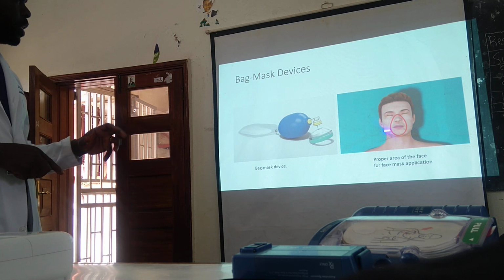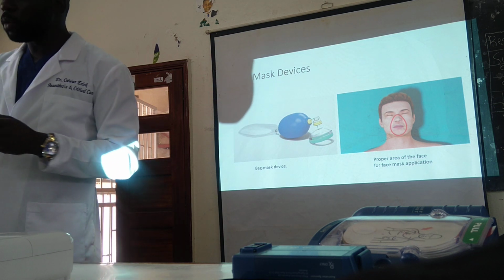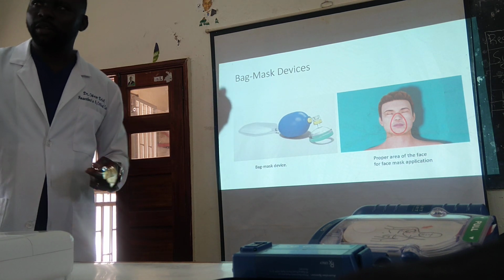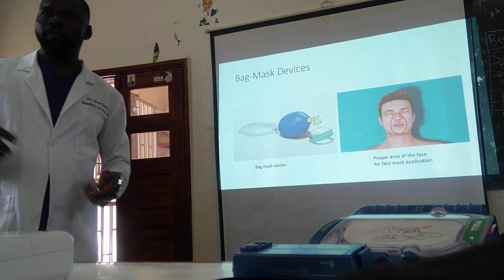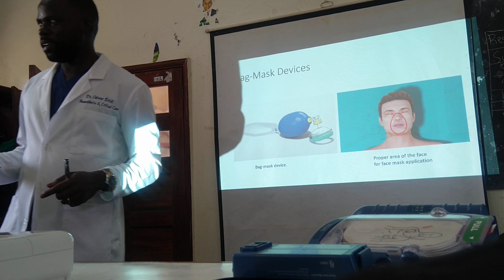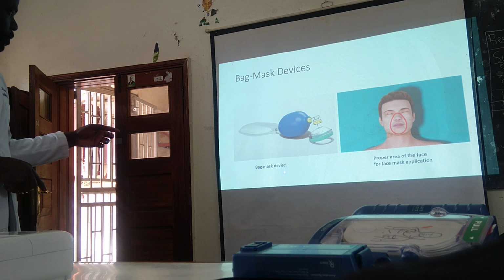Patient with micrognathia. What is micrognathia? Small jaws. Mouth is just like a full stop. Because of the way these masks are made, they have a curve down. And you know, these medical equipments, they made them in such a way, like individuals are the same. There are no special considerations taken. But of course, you try and use within your means, save a life at the end of the day. So this is what you use, mask device.